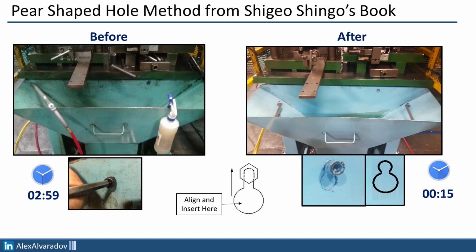As part of the changeover, the first and also the last activity that you have to do is to remove a funnel to be able to place the cart table with the bolster press. To complete this activity, on before situation, they had to use a hex key, taking almost 3 minutes, and after the team came up with this idea, that is also recommended on Shigeo Shingo's book, they were able to do it in only 15 seconds.